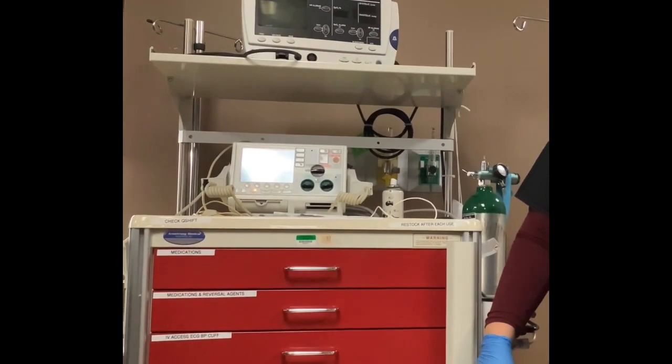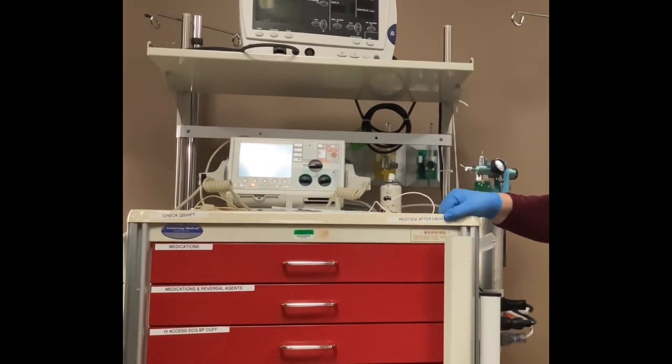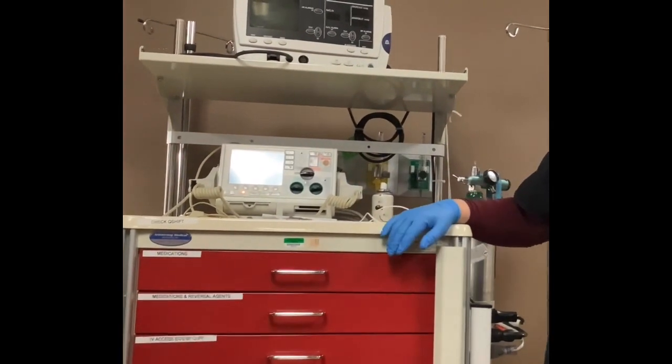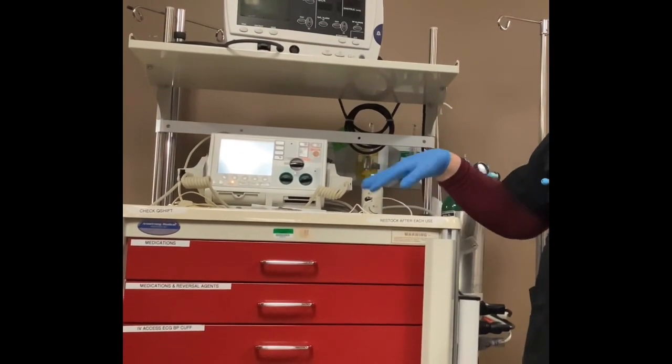Okay? Is this machine portable? This one is, yes. This is our crash cart, so if somebody goes into a code, we just bring the whole thing over. If a patient is coding or is unstable and needs extra attention, this is what they get. Every crash cart is red and has all this stuff on it, but we'll learn more about that as we go on.